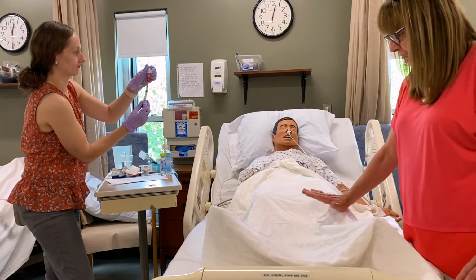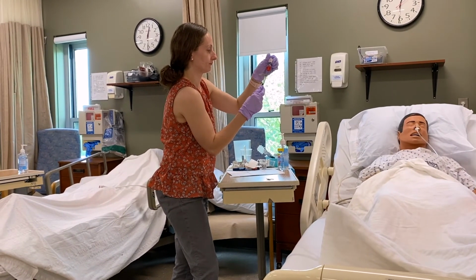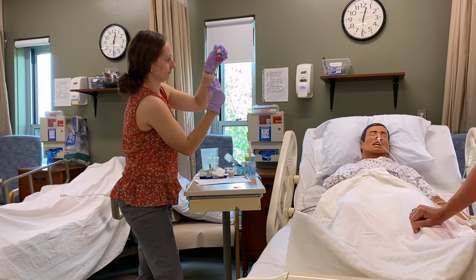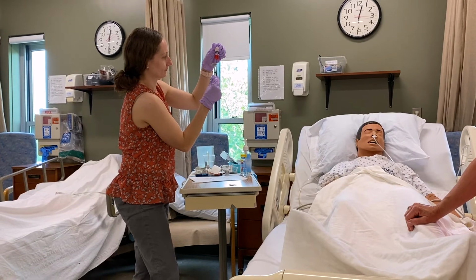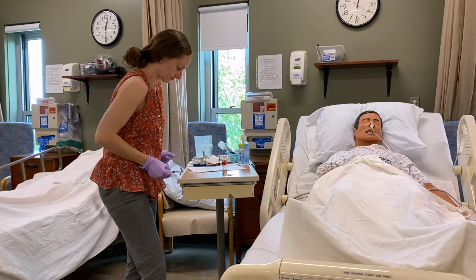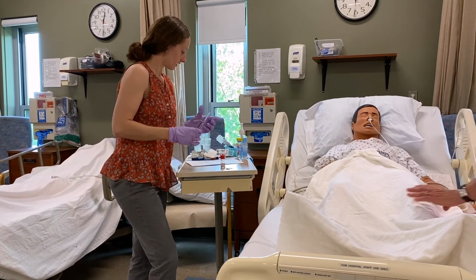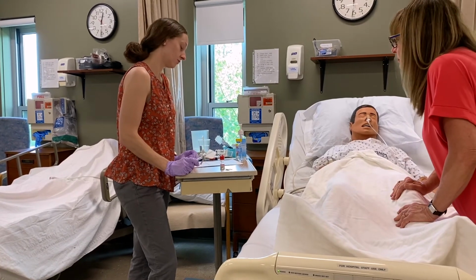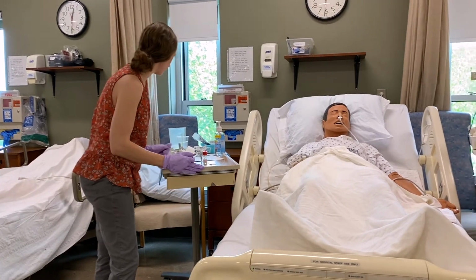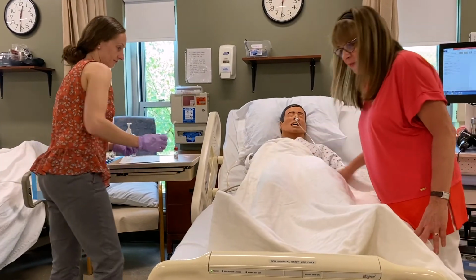So she pushed down on the cover, and it puts the diluent into the powder. You shake it until it's clear. And now she's going to be drawing 1.6 mLs of steroid. And why is this patient on a steroid? Let's look here at the diagnosis. So he has a pneumonia, he's got a VTE, he's got lots of inflammation going on in his body. Super. And what will that do to his blood sugar? It's going to increase it. Very good.